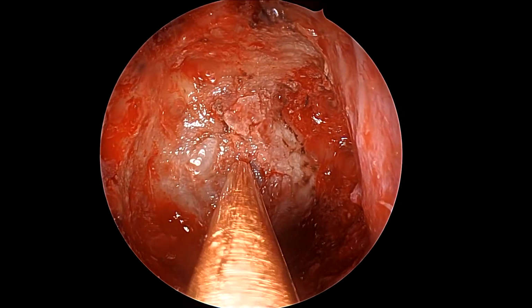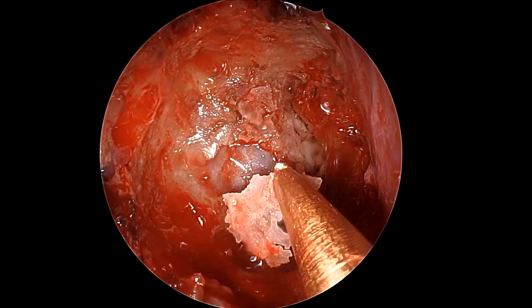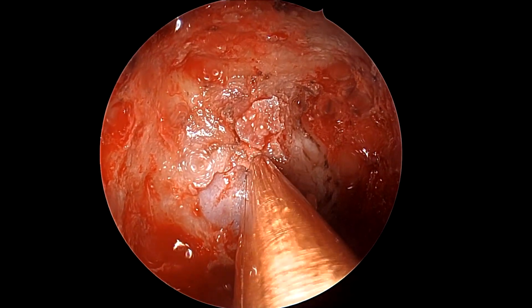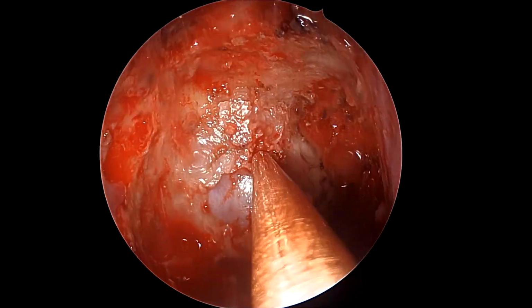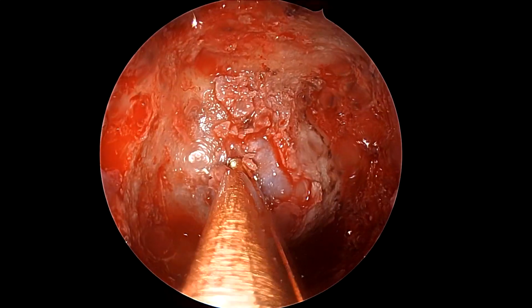Now, once we have seen that we have exposed the periosteum, now we can start chipping off the bone of the Sellar progressively. We always begin in the center and move laterally. As we move laterally, of course, we would be using the Doppler as well to approximate our location of the carotids. The CT navigation, unfortunately, in this space placement we were using is of not much consequence.